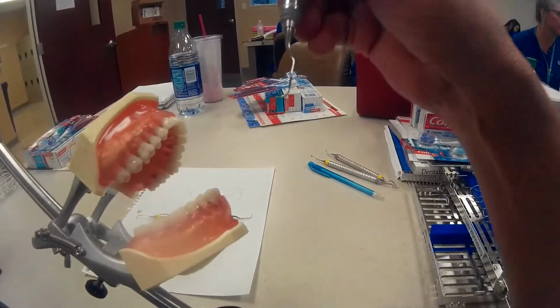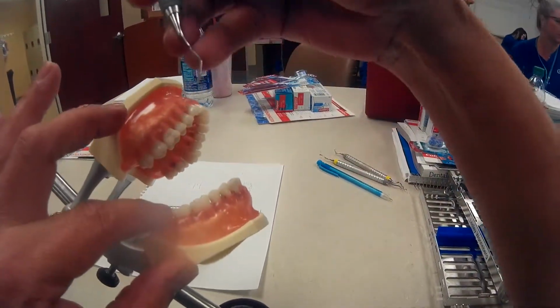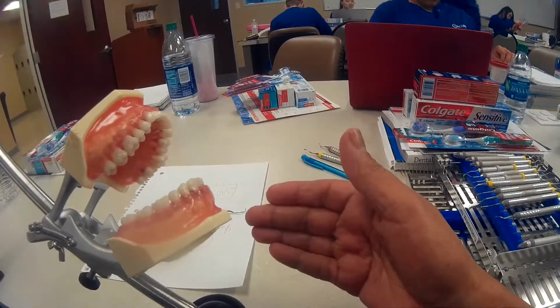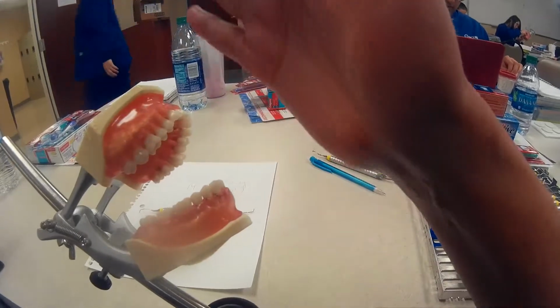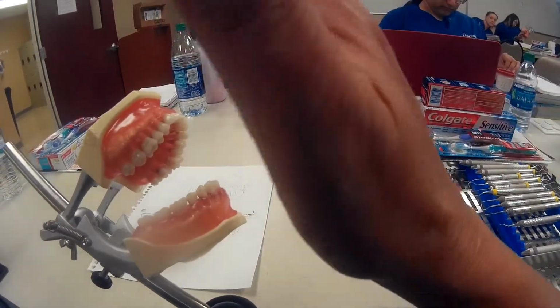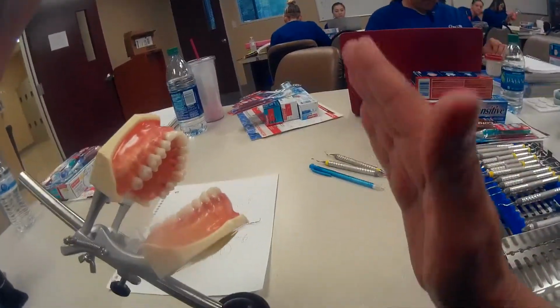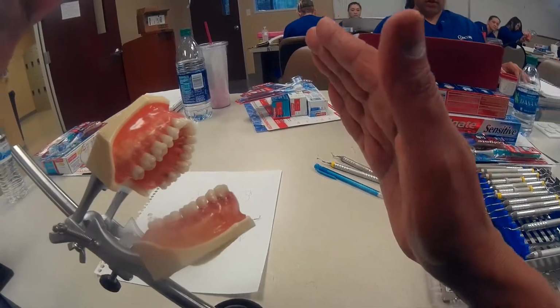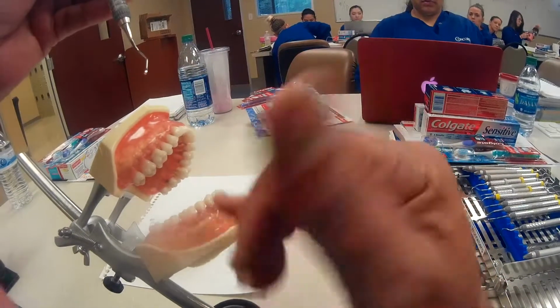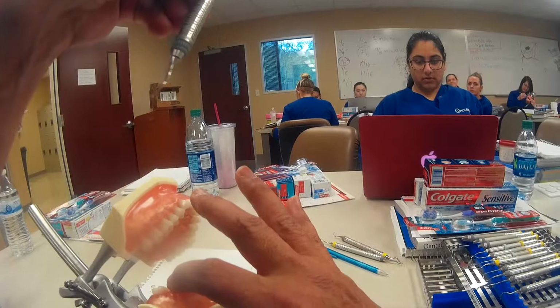All right, so now I want to make sure that I have the right one for this particular sextant. So my next step is to identify my cutting edge. My cutting edge is identified by me holding the instrument with the terminal shank at 12 o'clock, up and down, and then I identify the side of the blade that tilts down. Okay, and that's what makes this area specific. All right, so this one tilts on this side, but my distal surface is on this side, so that's not going to be the one that I want.